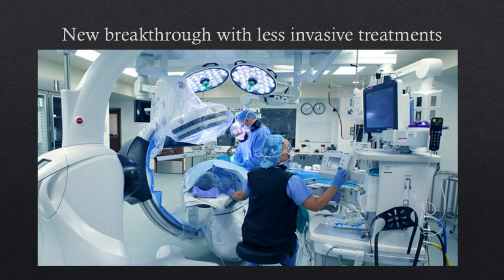New device technology allows for highly compressed stents, valves, and other tools to be run up straw-sized catheters and into the heart with a small incision. This amazing combination of advancements in tools, devices, and imaging, paired with highly skilled interventionalists, are why minimally invasive structural heart procedures are rapidly evolving.